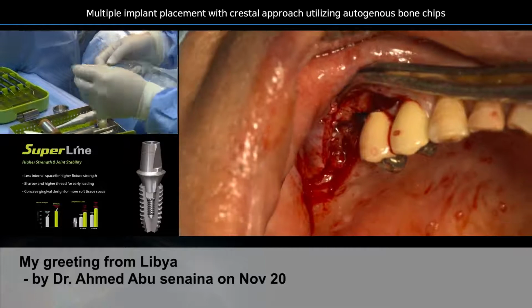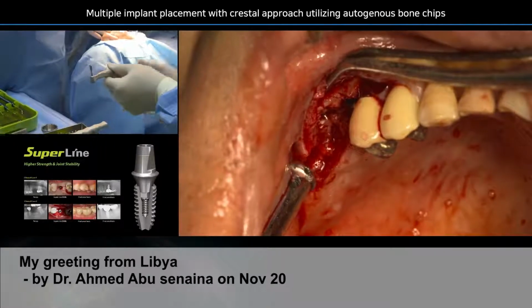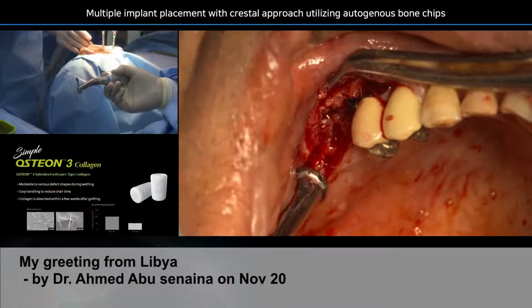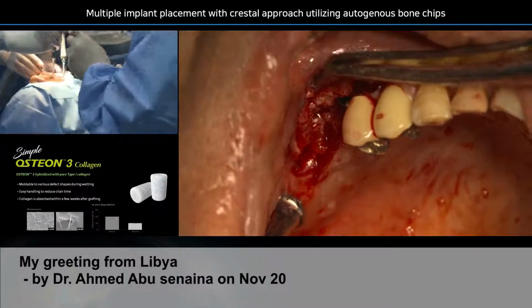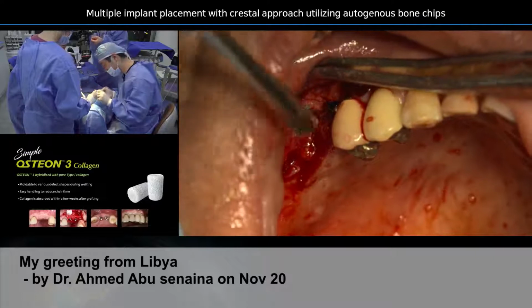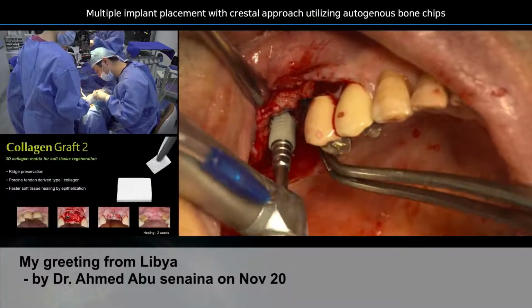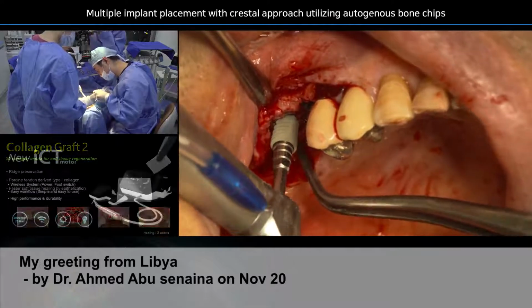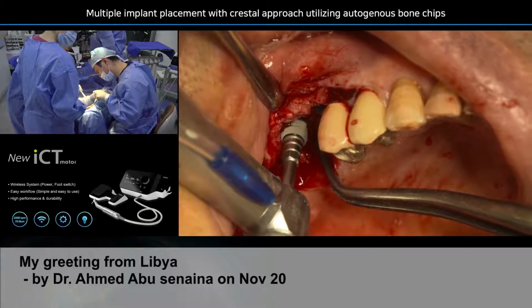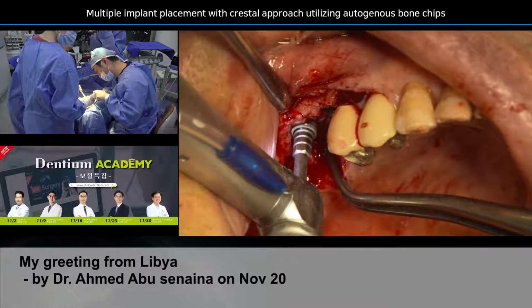Secure. Tip it over. And then carefully we're going to place it. So I need the Periosteal Elevator for the proper positioning. And finally, this is your last chance to correct the path and depth and everything. So take your time, do not rush, check everything, and then start your placement. So slowly, one by one, and one by one.